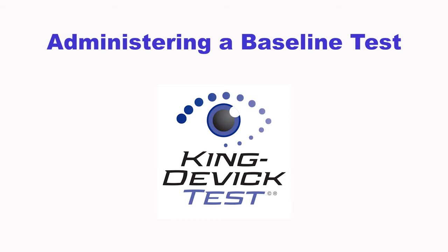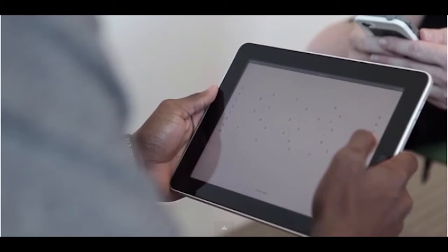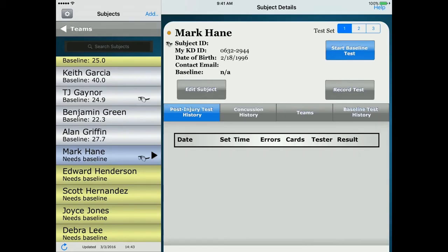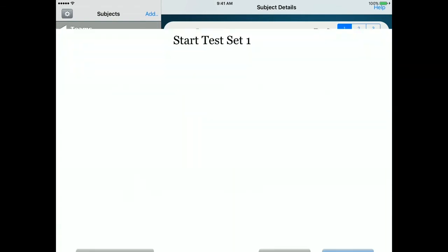A baseline test is a pre-injury baseline test score determined by following the baseline testing protocol, which establishes a test score as the faster of two error-free trials. The KD test app allows you to administer baseline tests directly on the iPad and syncs with your KDTOS account. Select the subject you would like to begin baseline testing. Baseline testing is available for new subjects that need a baseline score. Select the test set by tapping on the test set number in the upper right corner, then tap Start Baseline Test.